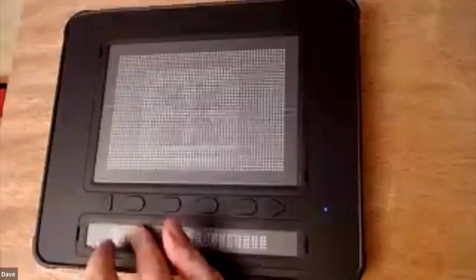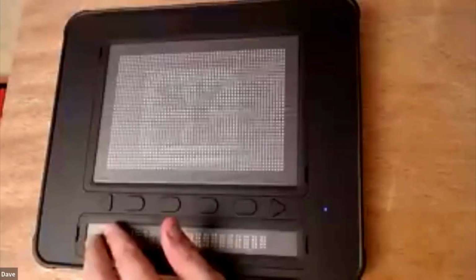Okay, I might actually jump to a related question instead of just going to the next in line. Kim has asked, can you read with Multiline using the Easy Reader app? Yes. There you go, easy.